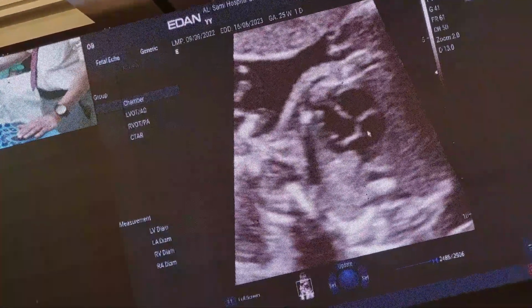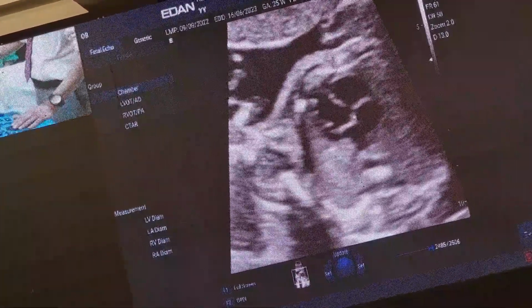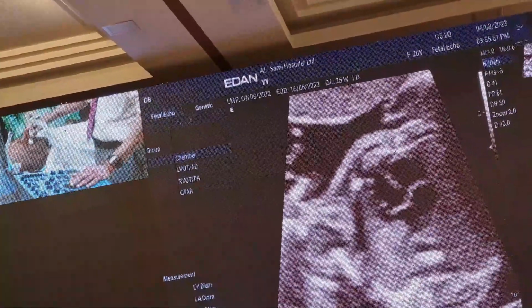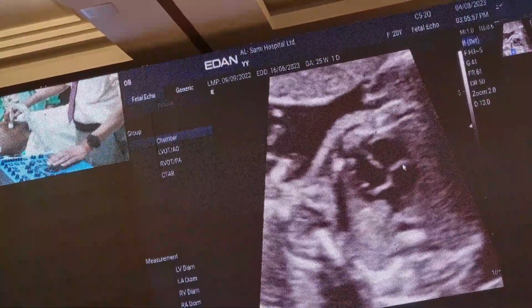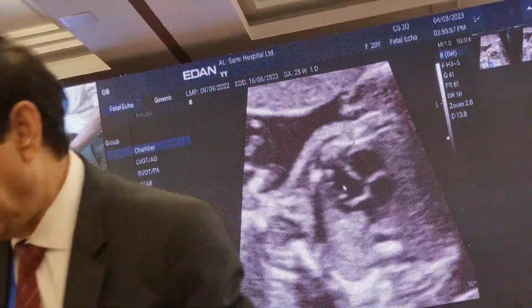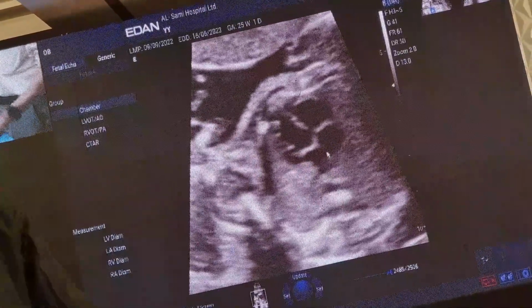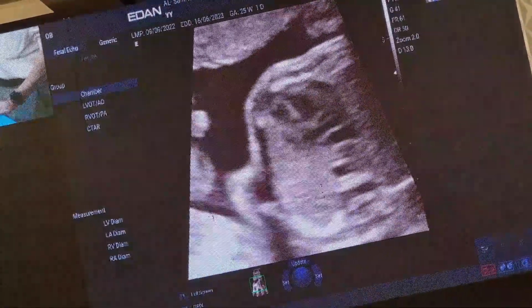Maybe. You can also appreciate one more thing: if you look at the leaflet of the tricuspid valve as compared to the mitral valve, is there a difference? This is definitely lower. This is known as an offset valve, which is the tricuspid valve. And as Joyti said, the valves and the ventricles are loyal to each other. The tricuspid valve will always drain into the right ventricle. The mitral valve will always drain into the left ventricle. The valves always show loyalty between them. But the atria may not always be loyal. So we can have something like corrected transposition, where you might see that the atria are wrongly placed.